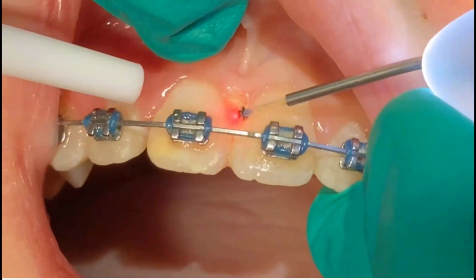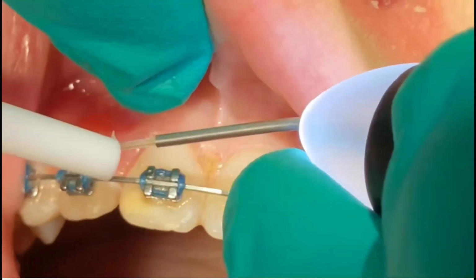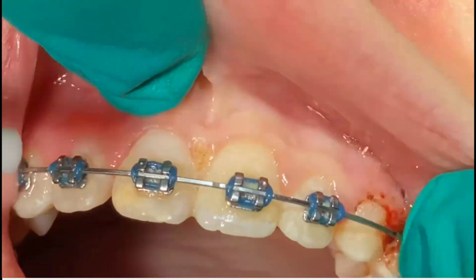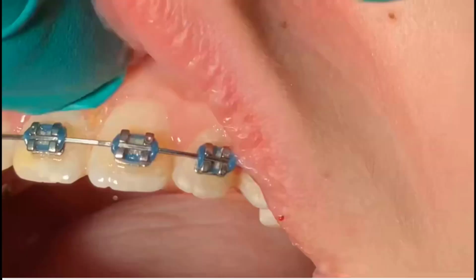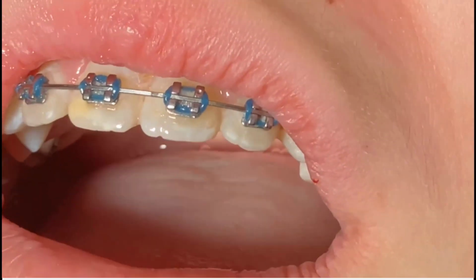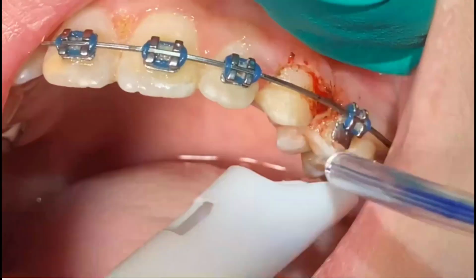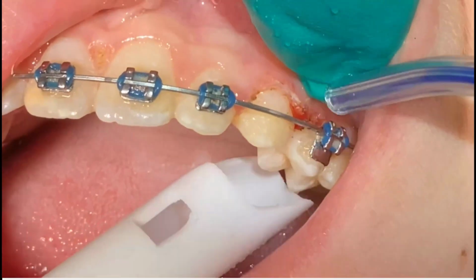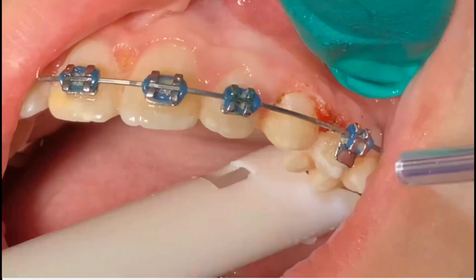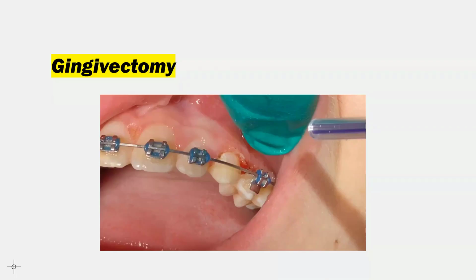And you can see how cleanly this cuts. See how clean just that is. Just like that. You don't have to do much to thin that out slightly. It's a slight cleanup, and that's how quickly you do a gingivoplasty of that tissue. Turn this way a little bit. What I'm going to do now is rinse that off. I'm going to have a regular suction. If you just rinse this off with some water, you'll see this is a pretty clean situation. It is completed. Very easy, very quick, and a great service to the patient.